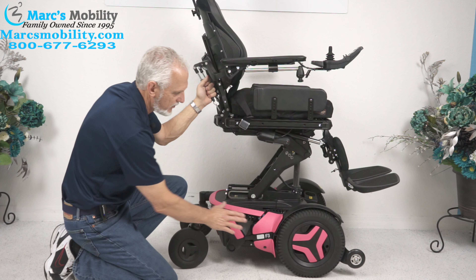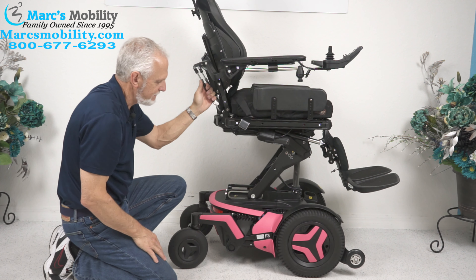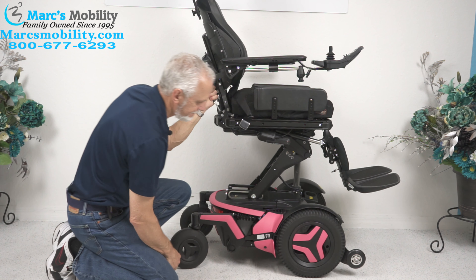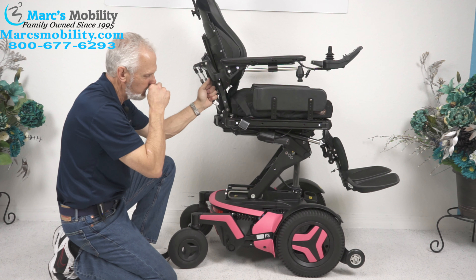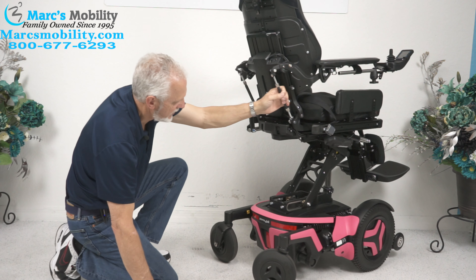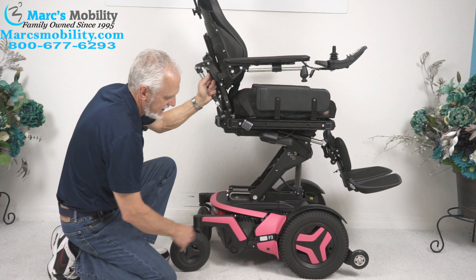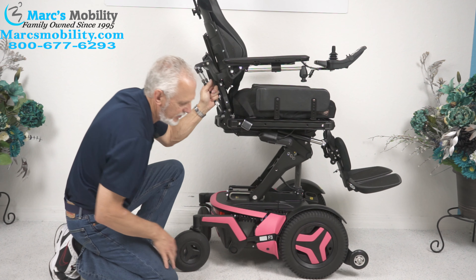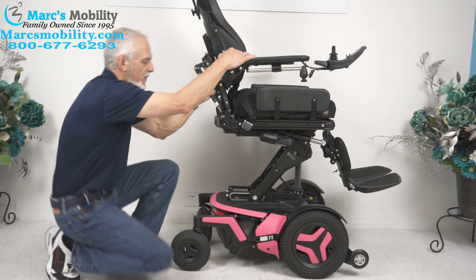There's a motor for each wheel. Right now the chair is in gear, so I can't push it. Right here is the end of the motor — you can see the handle on the motor; the motor goes right to the wheel. If I want to put it in neutral, I would turn the power off and have the seat all the way down. You just push the handle down, which unlocks the wheel — you can see the wheel freewheeling now. That's how you put it in neutral: do both motors, then you can roll it around. Do not forget when you're done to put it back in gear — a lot of people forget that. Back in gear, then you can turn your power back on. The reason you want the power off is because when you have the power on and put it in neutral, you might get some resistance from the electricity and the motor.